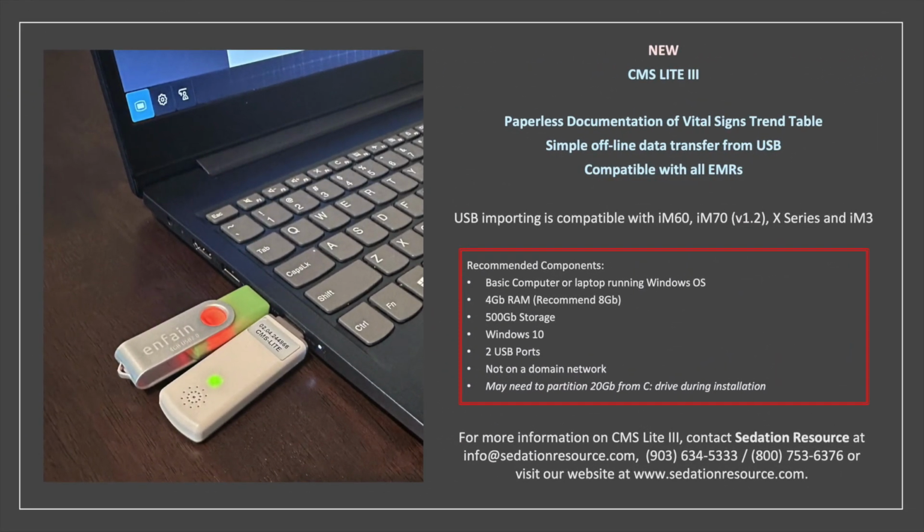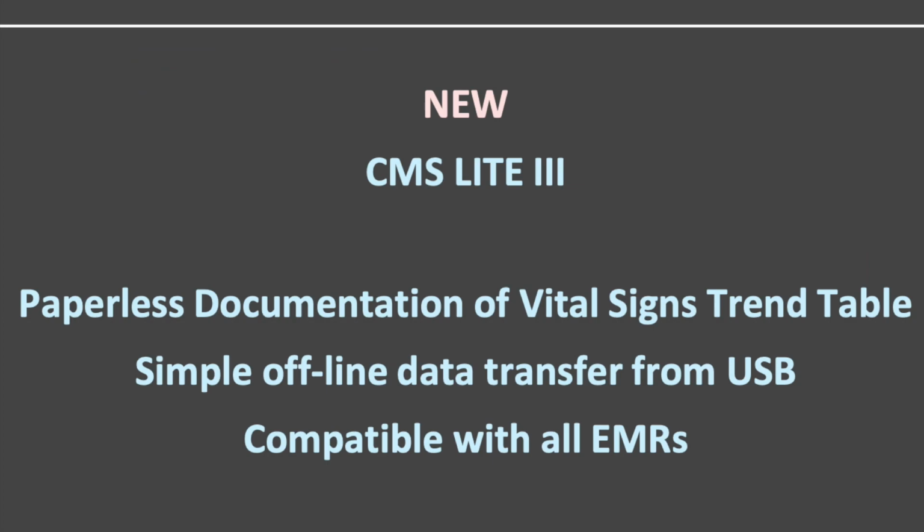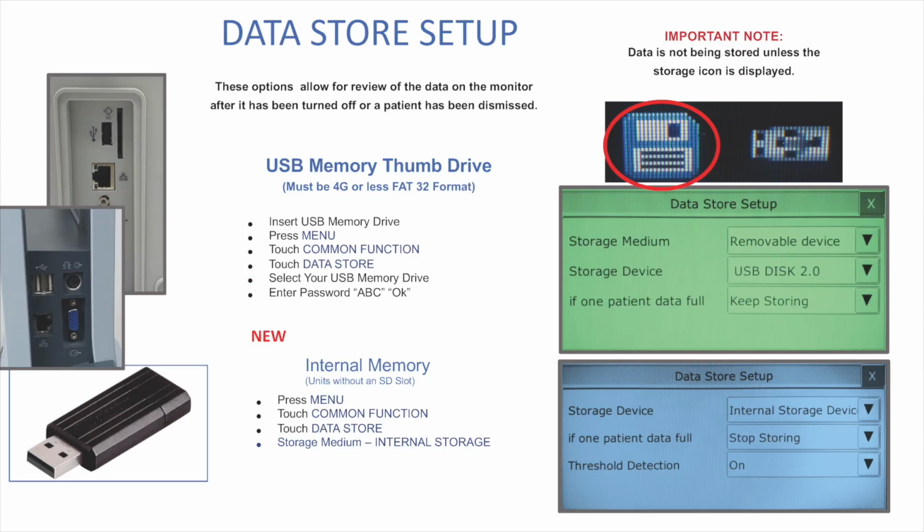In conclusion, with CMS Lite III's simple offline data transfer from USB and compatibility with all EMRs, you're set for a seamless, affordable transition to digital documentation.